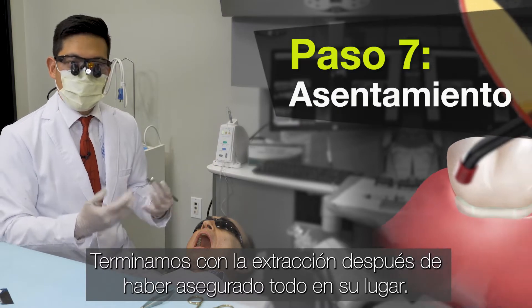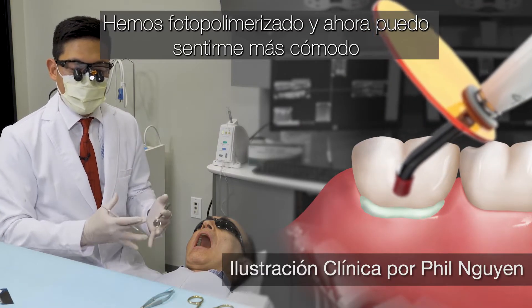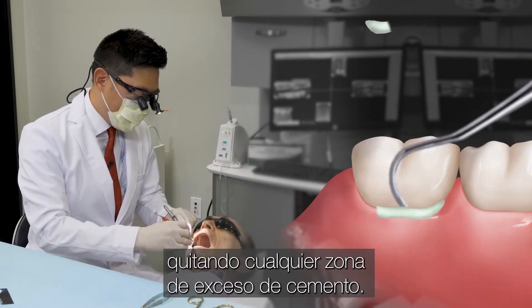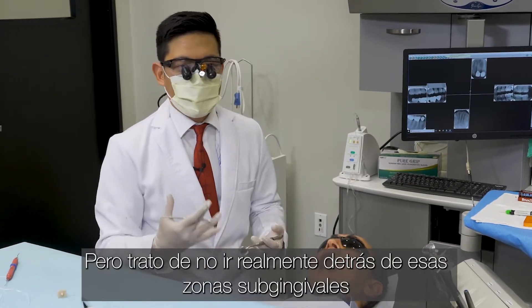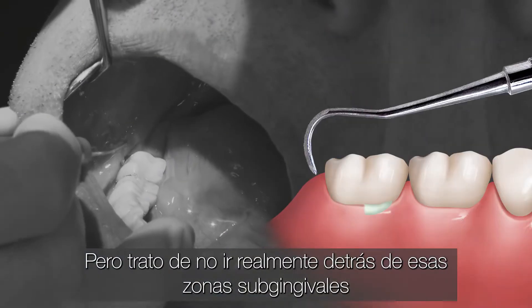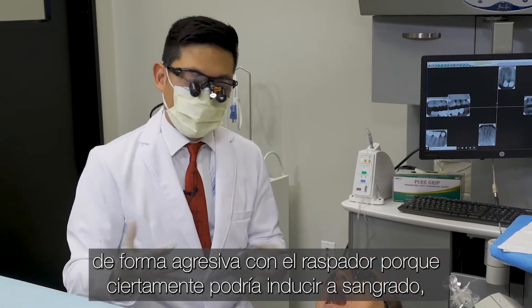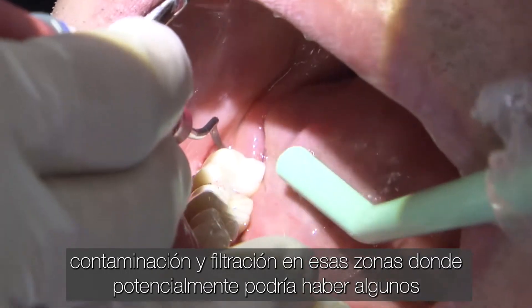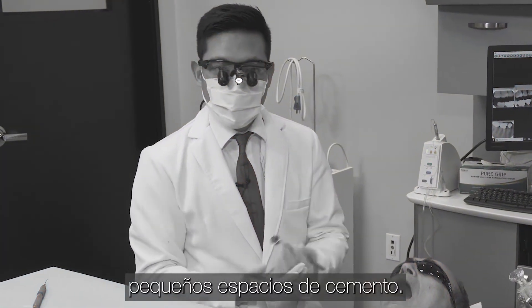We finish off with the removal after we've secured everything in place and light cured, and now I can feel more comfortable removing any areas of excess cement. But I try not to really go after those subgingival, equigingival areas really aggressively with the scaler, because it could certainly induce bleeding and contaminate and seep into those areas where there could potentially be some small spaces with the cement.